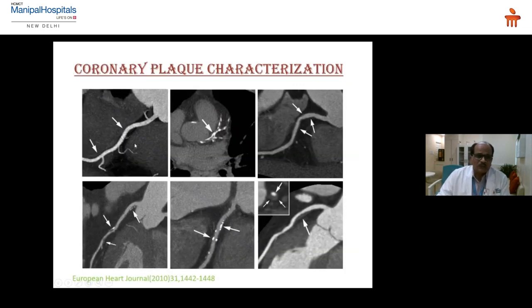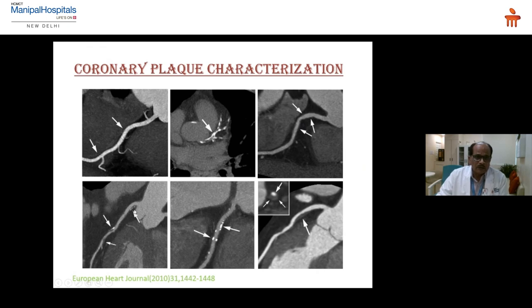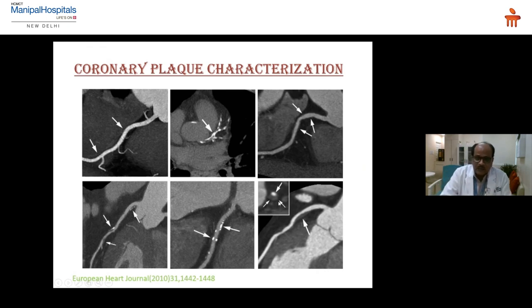This is a normal CT scan of coronary arteries. Here is RCA with dense calcification — very difficult to assess the lumen. These show various plaques with luminal irregularity and varying luminal narrowing. These are eccentric plaques, reactive plaques, and possibly vulnerable plaques. This is how we characterize the plaque load across the entire coronary tree.